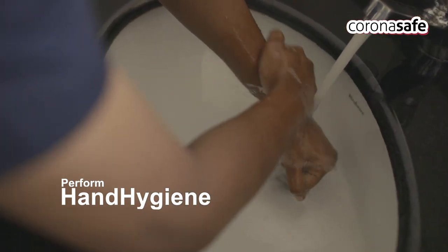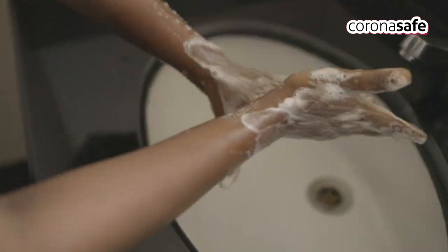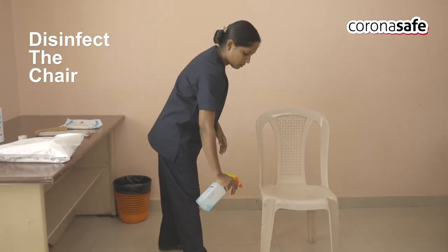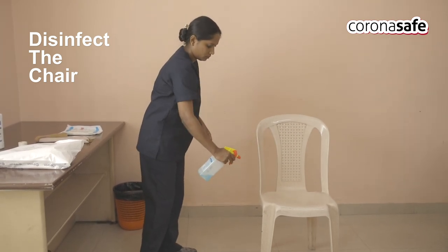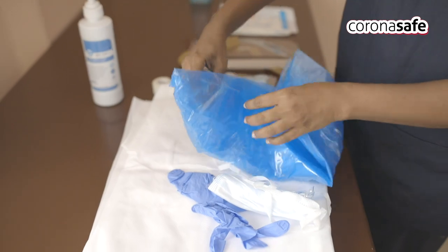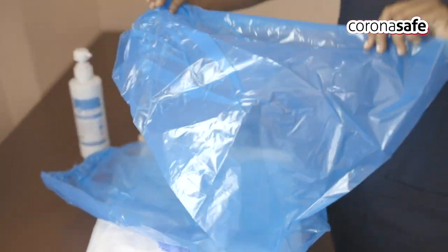Perform hand hygiene with soap and water. Disinfect the chair and area about one arm distance around the chair to prevent contamination of PPE while donning. Open the PPE kit and inspect for any damage of the components in the PPE kit prior to donning.